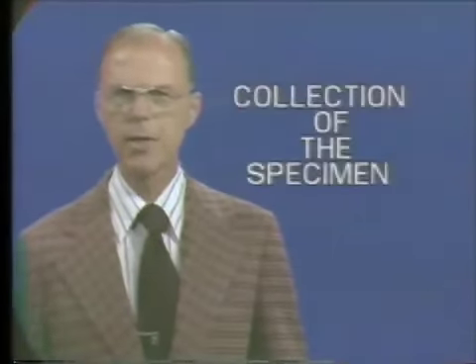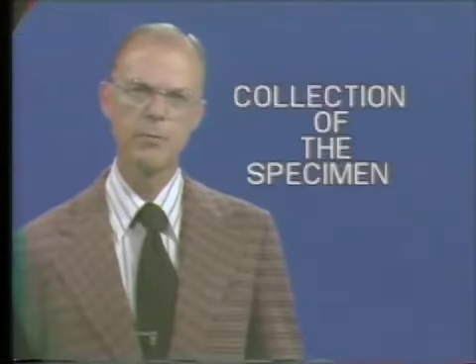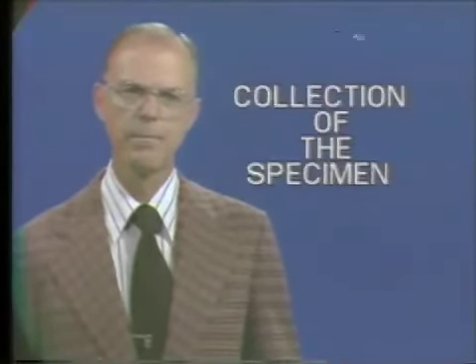The clinical laboratory is a valuable source of supplemental diagnostic information. Laboratory studies are ordinarily done when there is an indication from the patient's history, clinical examination, or radiographic findings. The clinical laboratory employs the examination of body tissues, fluids, excretions, and secretions. The following demonstrations will illustrate the collection of the various specimens for shipment to the laboratory.